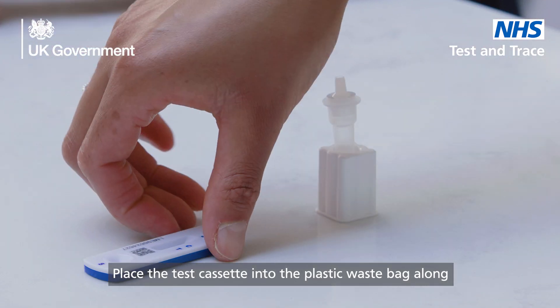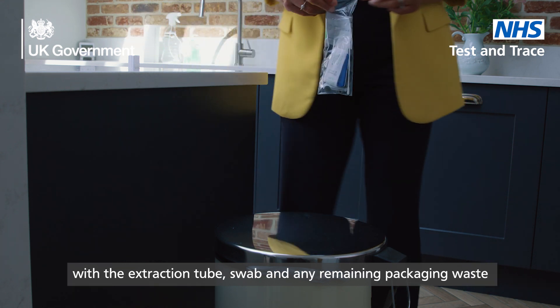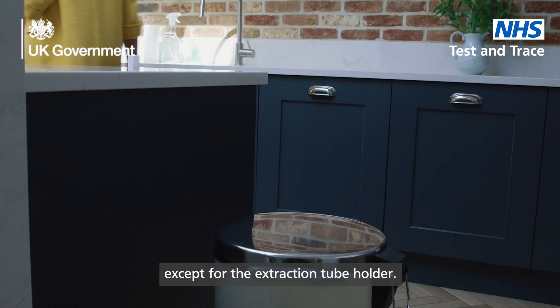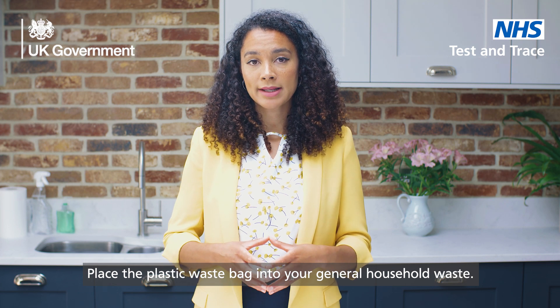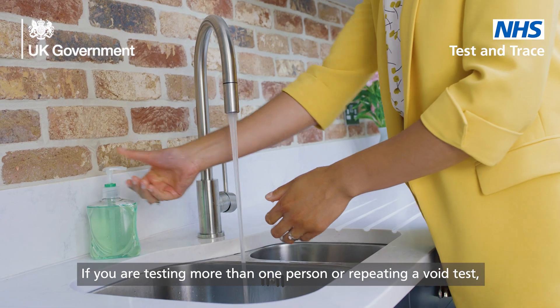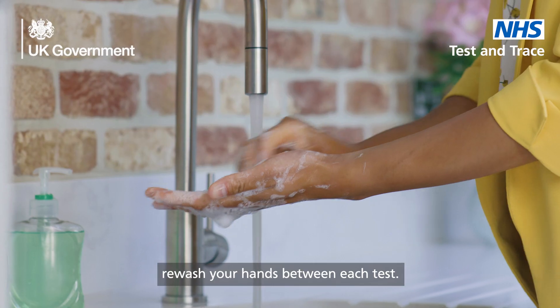Place the test cassette into the plastic waste bag along with the extraction tube, swab and any remaining packaging waste, except for the extraction tube holder. Place the plastic waste bag into your general household waste. If you are testing more than one person or repeating a void test, re-wash your hands between each test.